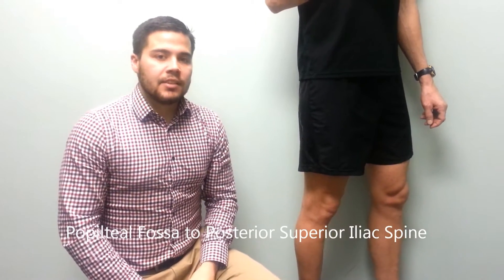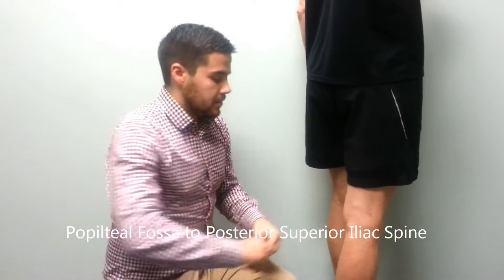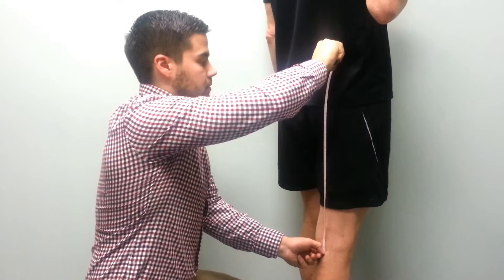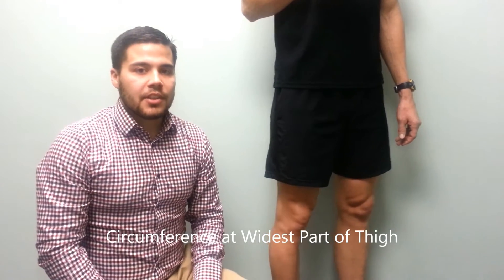Our next measurement is a length from the popliteal fossa to the posterior superior iliac spine. Our next measurement is a circumference at the widest part of the thigh.